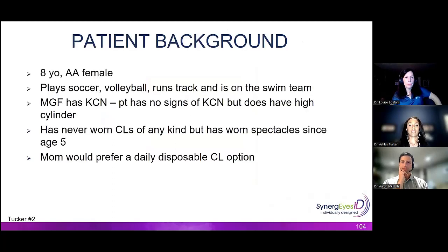So here we go. Yes. So I'm fortunate enough to work in a practice where 50% of our patients are children. So I have lots of opportunities to test these lenses out on kids. So this particular patient, at the time, she's almost 10 now, was an 8-year-old African-American female who plays every sport known to mankind. She does have some significant ocular history.